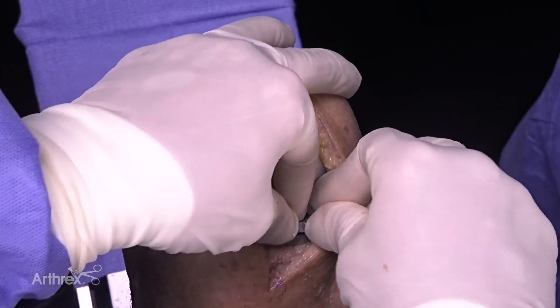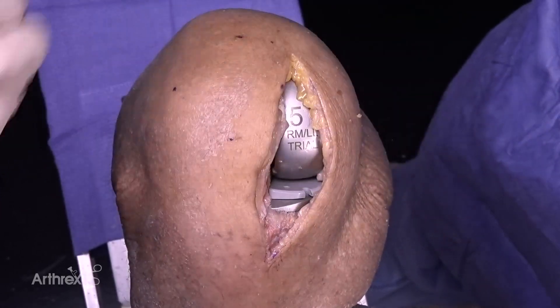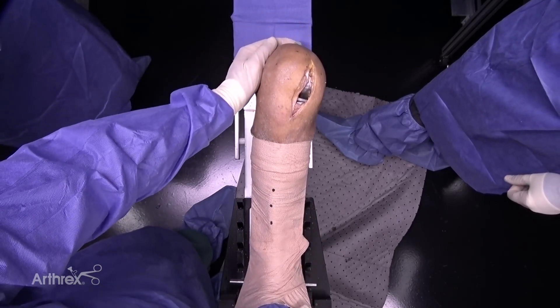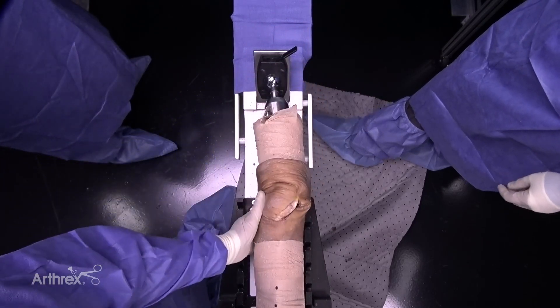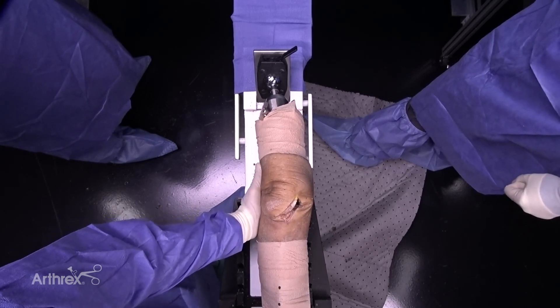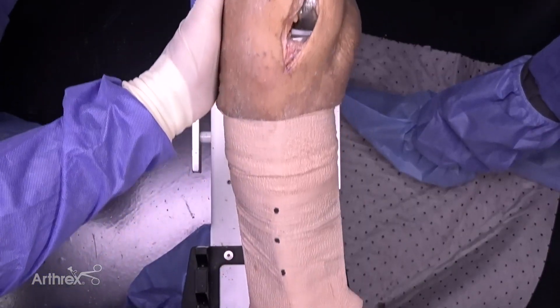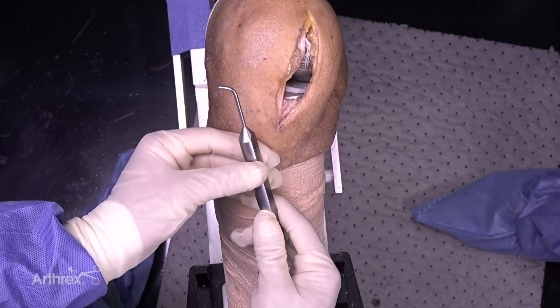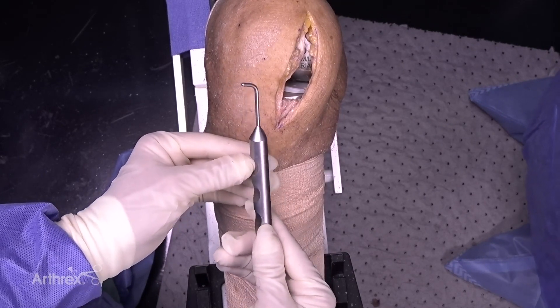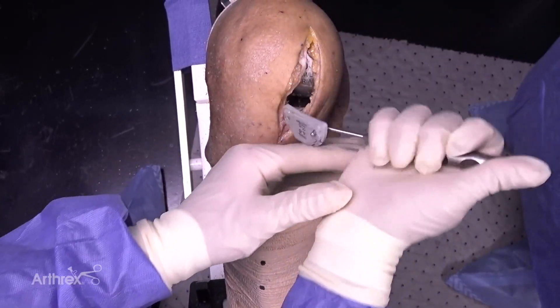At this point, we'll put a trial polyethylene in. I find it easiest to gently tap this down from the anterior medial aspect until it sits right in. Once the polyethylene is in place, I can check my flexion-extension — very nice alignment between the components and the knee. Flexion-extension is very smooth. I get fully straight and check my tension in the medial compartment — I want a couple millimeters of play. This one feels perfect with the 8-millimeter poly. The trial polyethylene is removed using this device: it fits into the hole, you flex it up and pull straight out.